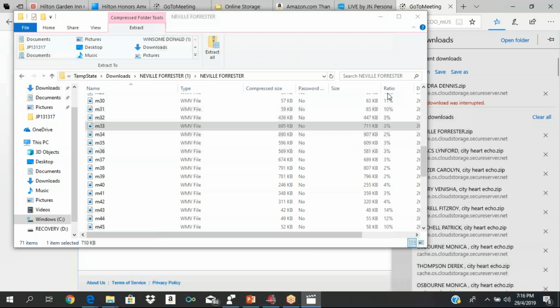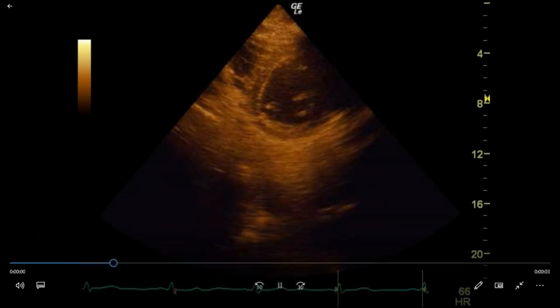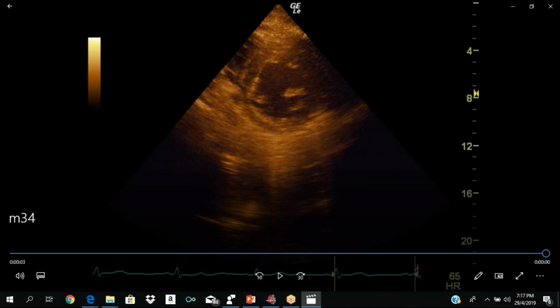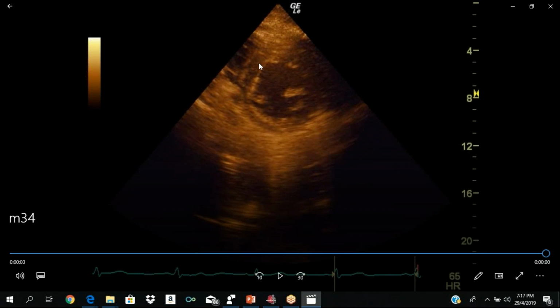So you need to know how to name the different structures because the exam is filled with that. So again, you're going to move the handle of the transducer upwards, and then this is the base. Okay, so at the base you have the mitral valve, of course, and remember what we said, this is the anterior wall up top, this is the inferior wall below. Okay, the lateral wall is over here, and the septum is right here.